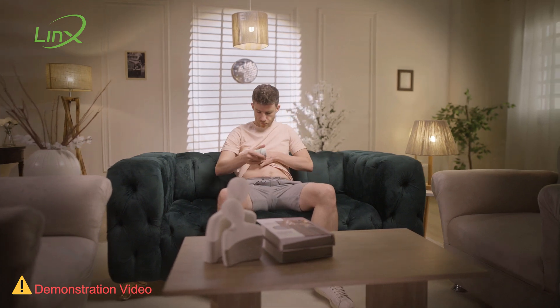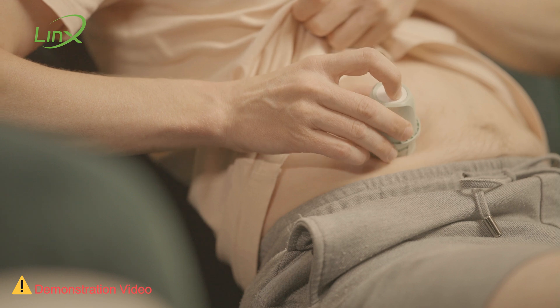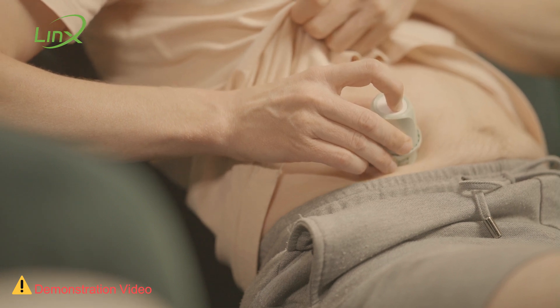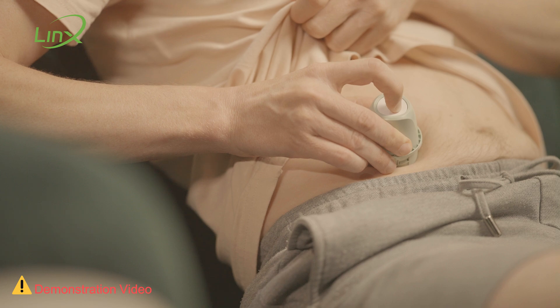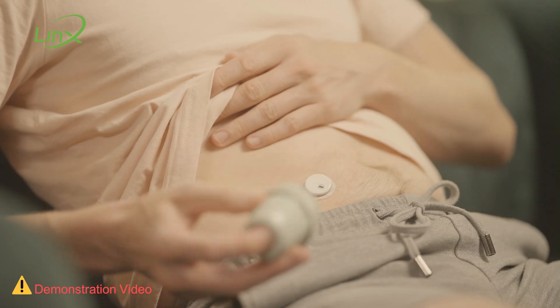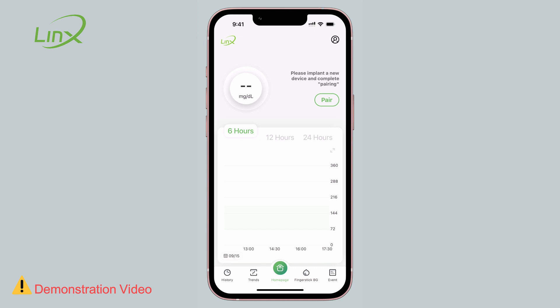Place the sensor applicator directly on the skin without applying much pressure or stretching the skin at the application site. Press the white button on the sensor applicator. Wait for 10 seconds. Carefully lift the applicator off the skin. The installation is now successfully completed.